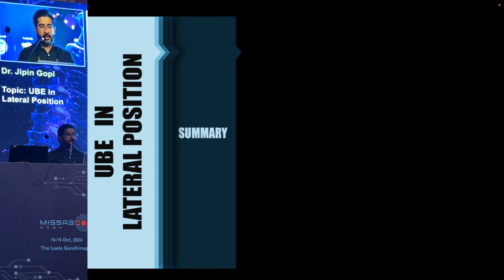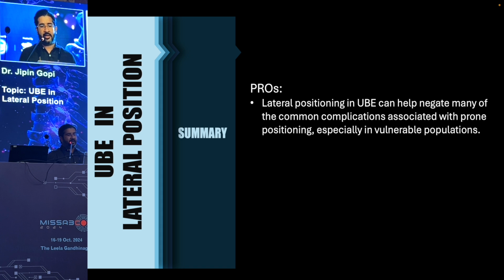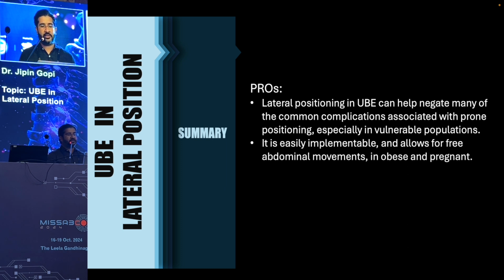So let's quickly summarize. Pros: lateral positioning can help negate many of the common complications associated with prone positioning, especially in vulnerable populations. It is easily implementable, allows for free abdominal movements in obese and pregnant patients, and positioning can be achieved with minimal manpower.